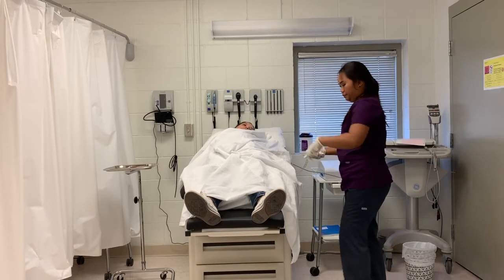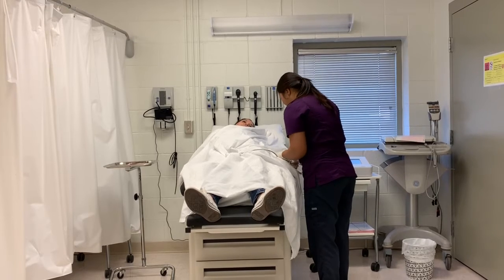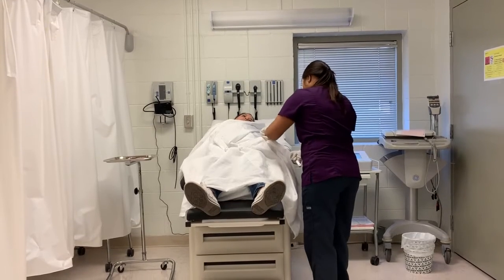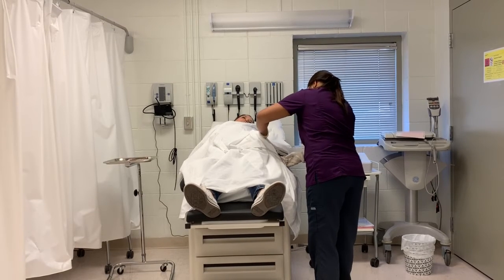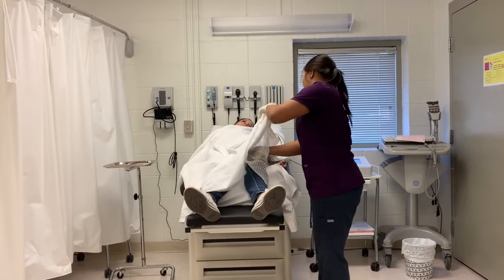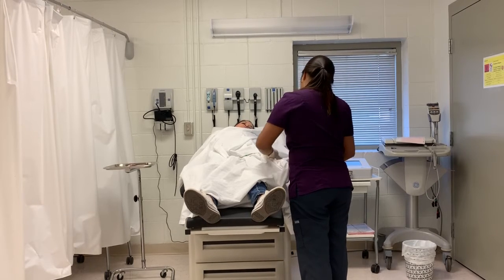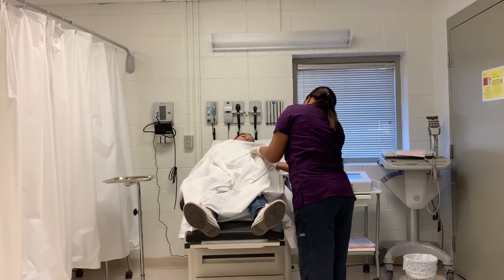The left arm. We want to make sure all the wires do not tangle, making a stress loop, so that it doesn't pull.